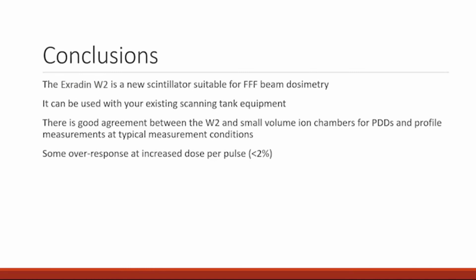I was wondering if you could tell us a little bit about how difficult it was to get the W2 set up in your water tank, since you weren't using a standard imaging water tank. Do you want to talk about that just a little bit? I'd be happy to. It was pretty easy, except the W2 is so much thinner than the housing on the ion chamber.